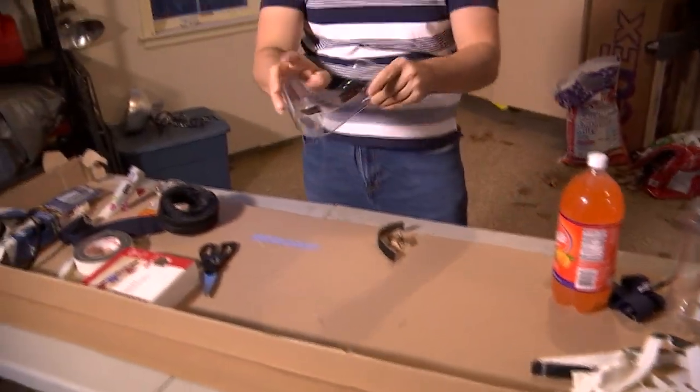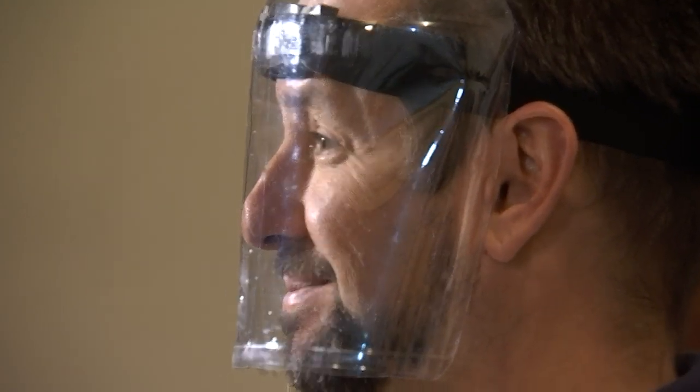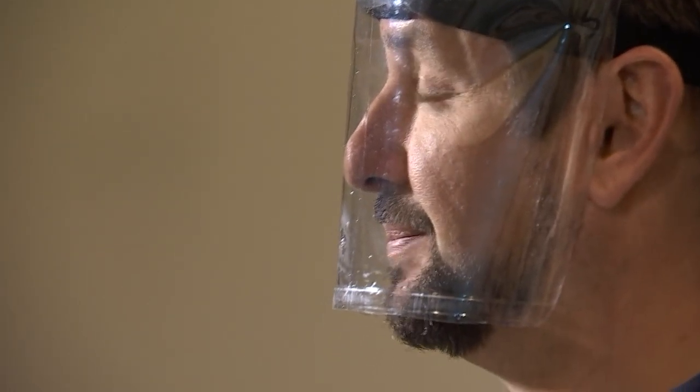Your face mask will adhere directly to the headband. You can also put goggles underneath it or wear a mask underneath it.